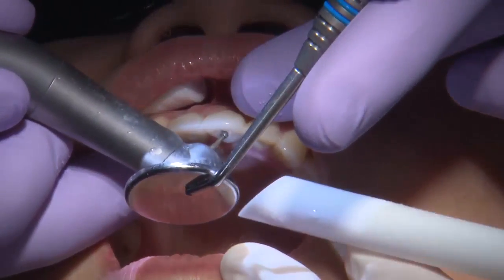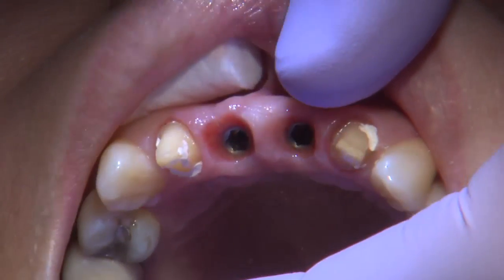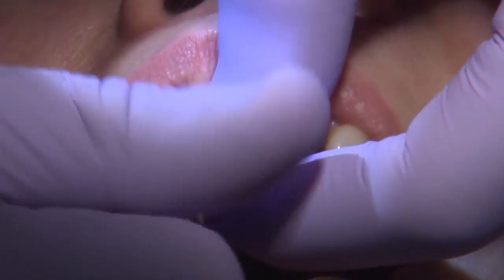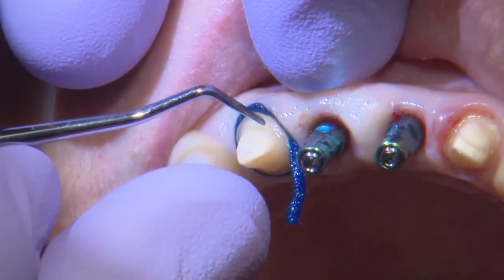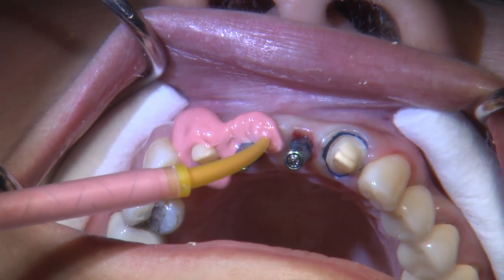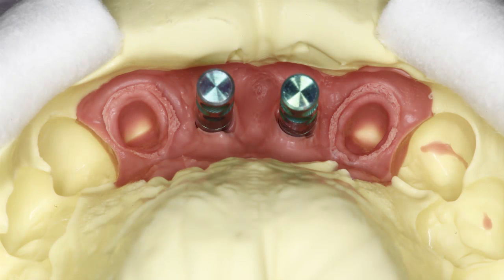If I don't have proper contours, this is the stage where I can utilize the temporary to create the contours I need for my final restorations — and the gingival contour is going to be really important for the final aesthetic result. Once we have the temporaries in the proper position and I know I have proper contours, I'll take a final impression. This was about four months after the implants were placed. I didn't think tissue preservation techniques were necessary in this situation because the patient has a very thick gingival biotype, so I went directly to fabrication of the final restorations.